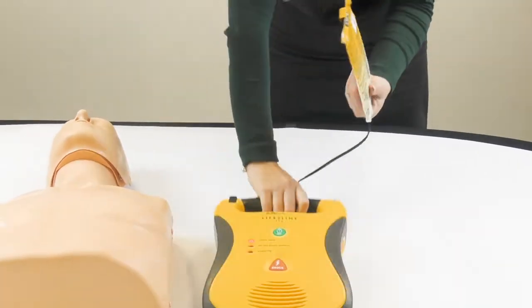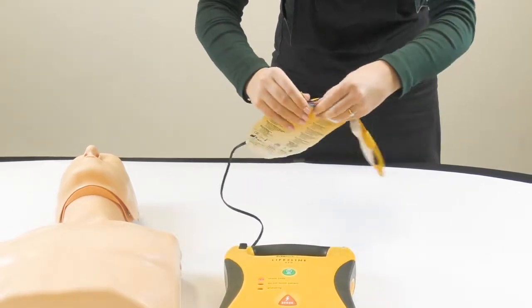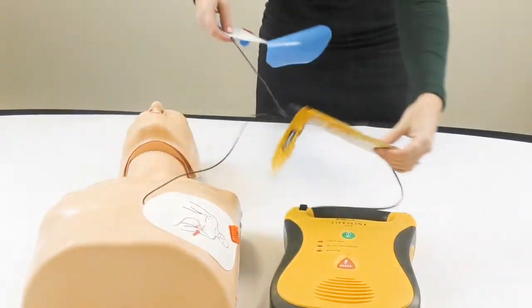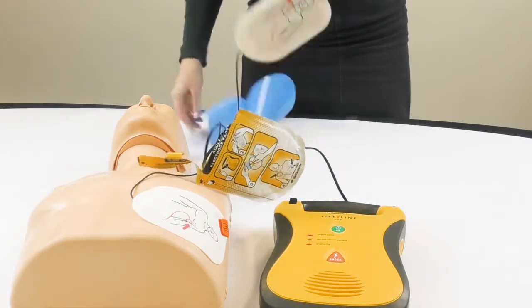Apply pads to patient's bare chest as shown.